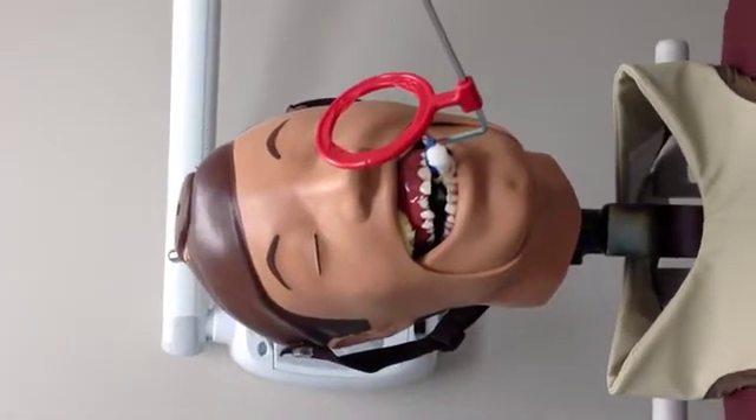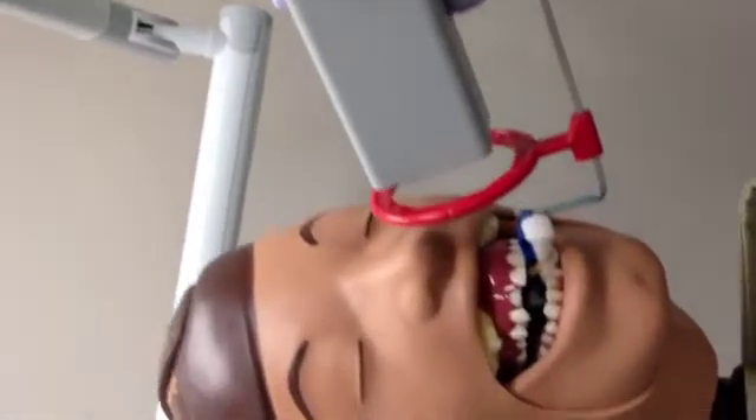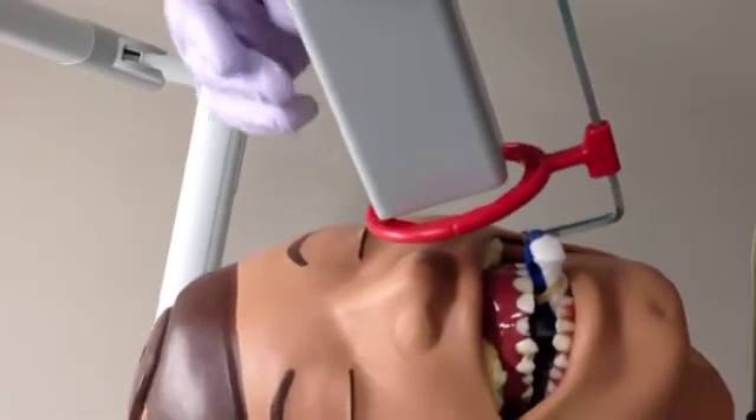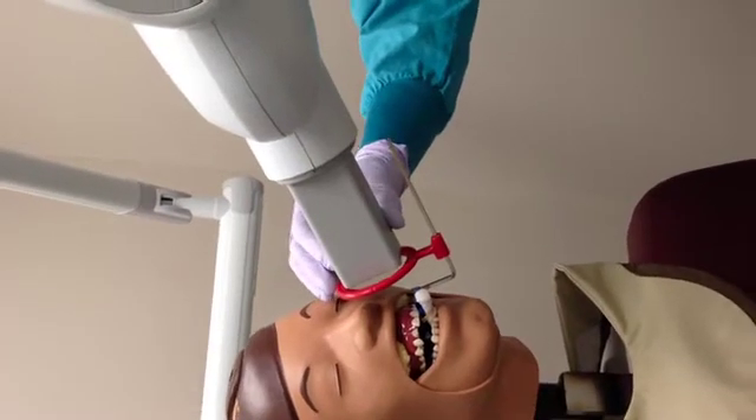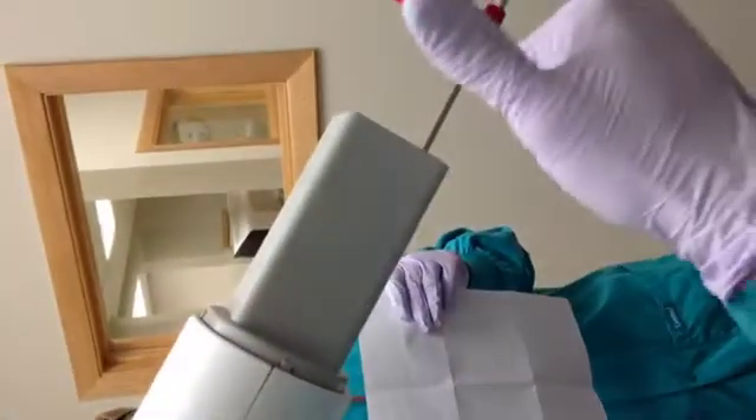Now the X-ray unit is ready to be aligned with the XCP. The horizontal and vertical angle must be considered. For the horizontal angle, the PID should be lined up perpendicular to the facial surface of the lateral incisor. For the vertical angle, the X-ray unit should be pointed downward at a positive 20 degree angle. Having these two angles correct is necessary to obtain the desired image. The XCP makes doing this easy by allowing the operator to simply insert the PID into the grooves on the ring and make it parallel with the steel rod. The PID should be vertical to align with the phosphor plate. All of these angles will help us open the contact between the lateral and central incisors.